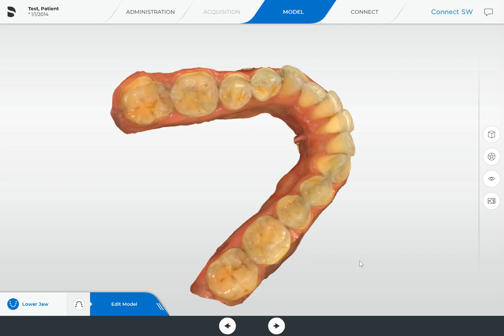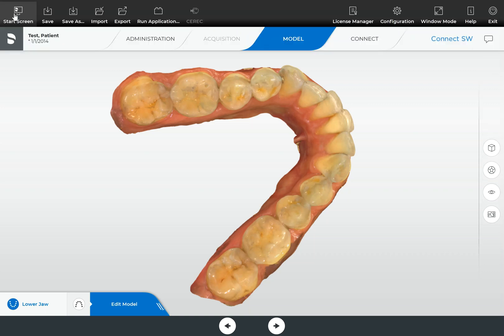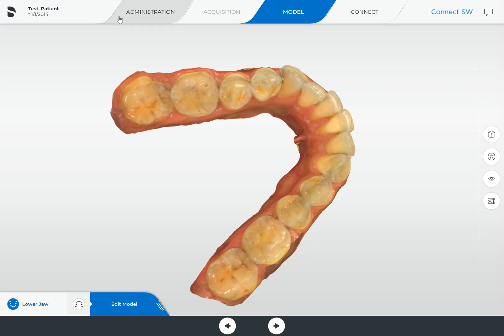Now in order to do this, all we need to do is go up to the Dentsply Serona logo, or if you're working on an earlier version of CEREC, there would be a yellow arrow right here. We simply click on that, go to export.